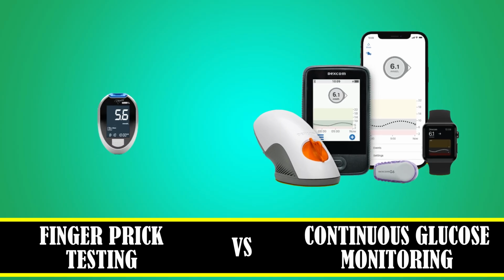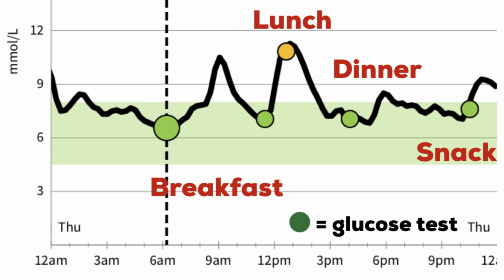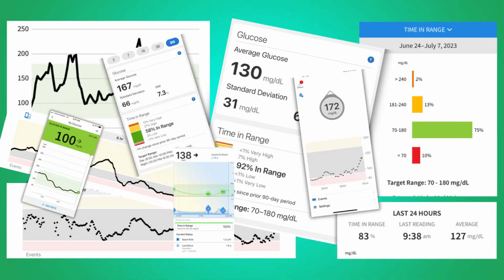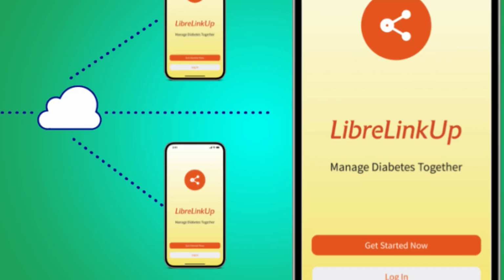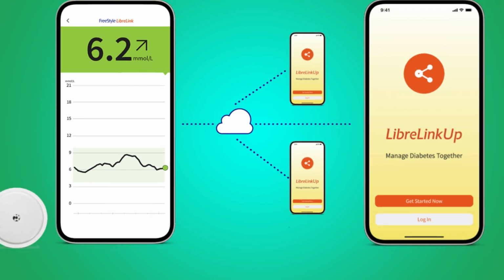The advantage of using CGM over finger prick test is that the CGM monitors your blood glucose at any time, 24 hours a day, and results can be sent to your diabetes team for monitoring. You can also send data to a family member or friend to help monitor your sugar levels.